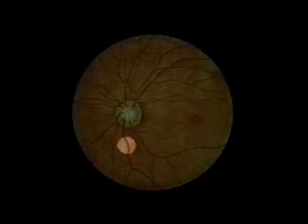While holding the red reflex in view, approach the patient's eye along a 15-degree line lateral to her line of vision until the ophthalmoscope is close to the eye. Try to find the optic disc by following the retinal vessels toward the place where they converge. Now bring the optic disc into sharp focus by adjusting the ophthalmoscope lens. Note the color of the optic disc, the clarity of its margin, and the size of the physiologic cup.